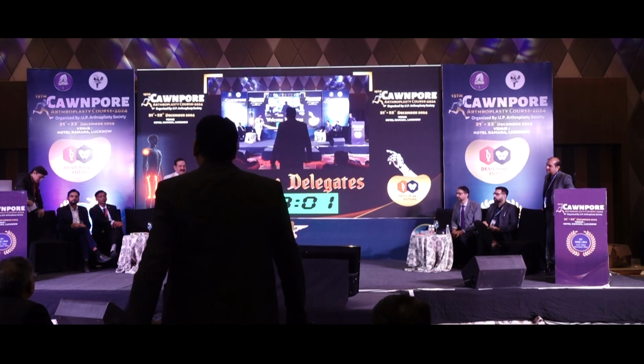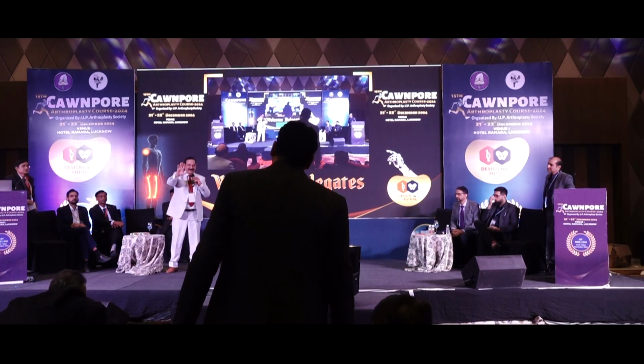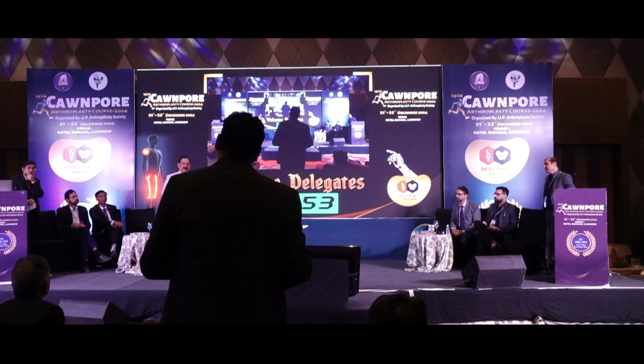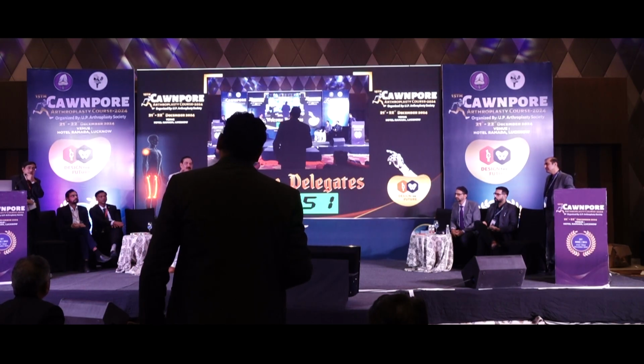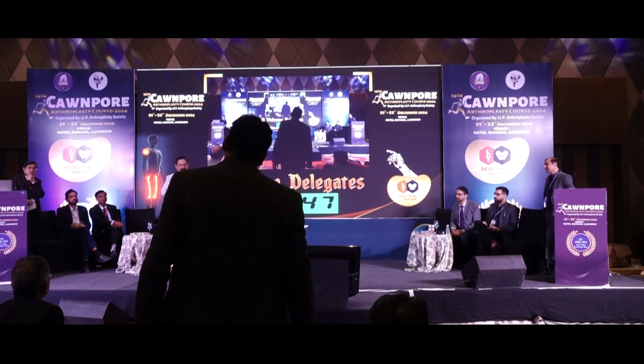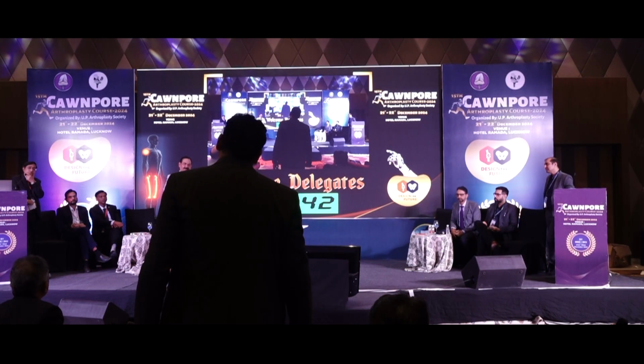Even on your plain X-ray, it is not difficult to identify osteophytes, isn't it? Superior osteophyte, anterior osteophyte, inferior osteophyte. One can do that. But if you are not too sure, it's a protrusio, you want to save the bone, you don't want to ream, go ahead and do your work. Put your cup on the rim. And then whatever is projecting and causing impingement, you take it off.